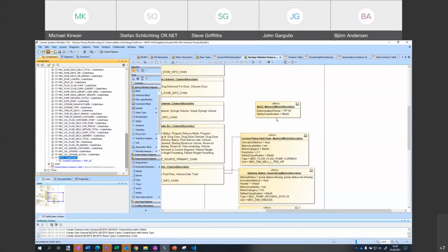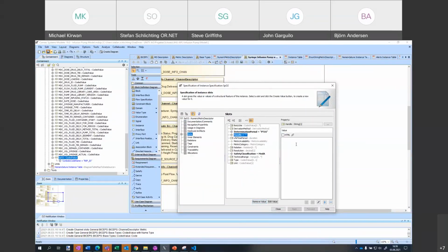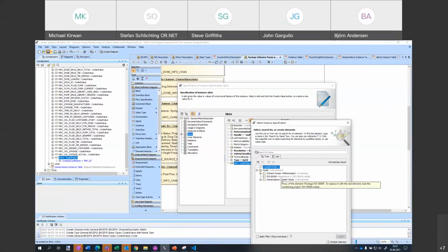And so now you would basically create it, say okay, define all your attributes, resolution, range, and here we need the type, and let's display both. So you can create them all. But would they be importable from some database? Yeah, that's what I currently work on with the script, to include them from the RTMMS, just for convenience. You could actually do that export of a value set for specialization from RTMMS to a CSV file or a spreadsheet, and then import that into that table. Yeah, I basically pass the JSON format.